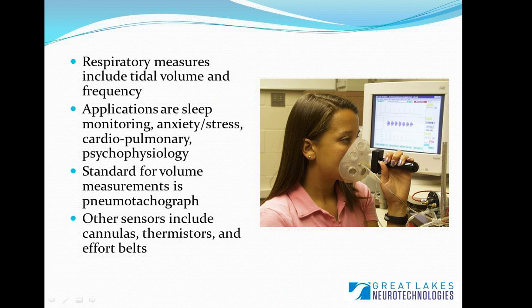There are several applications in which you might want to measure respiration, and just a few of those are sleep monitoring and trying to detect different types of sleep disorders, anxiety and stress research, cardiopulmonary research, psychophysiology. There's quite a few. Exercise physiology is another one in which monitoring respiration can be an important measure.